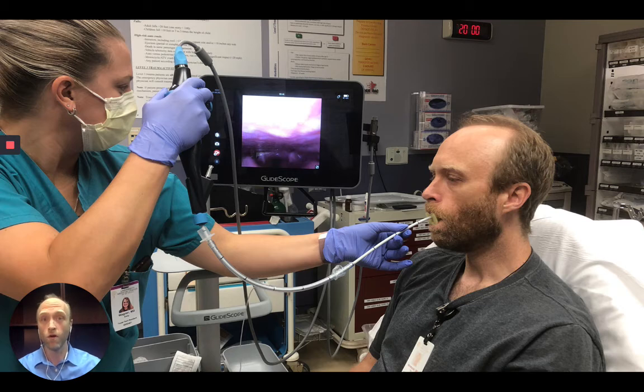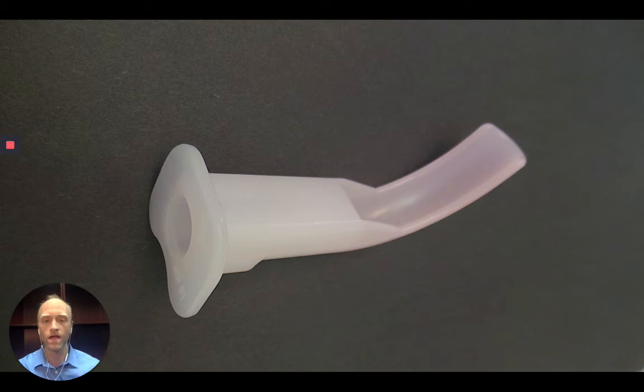So here's a photo of the resident performing the procedure through the oral route. And as I already mentioned, it requires greater skill to drive the scope when going through the mouth because the turn is much sharper. An oral intubating airway, such as the Williams airway intubator, can help guide the scope and keep it midline. However, with increasing operator skill, it is not needed. And so if you don't have an oral airway, if you put traction on the tongue, it will give more room in the oropharynx to make the turn toward the larynx.